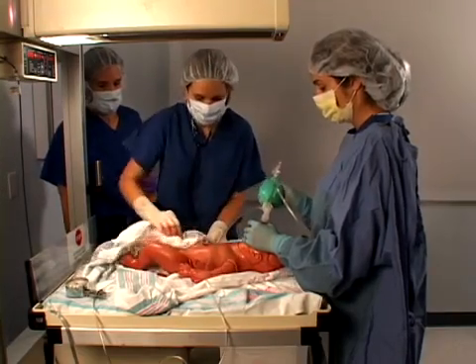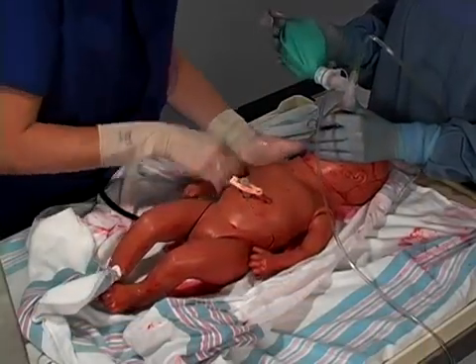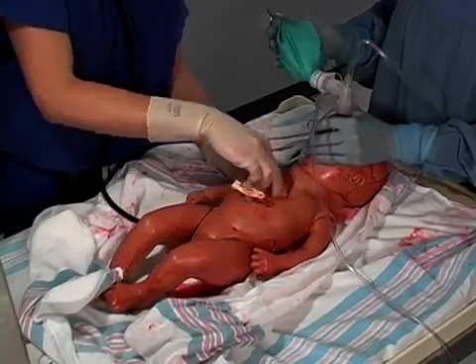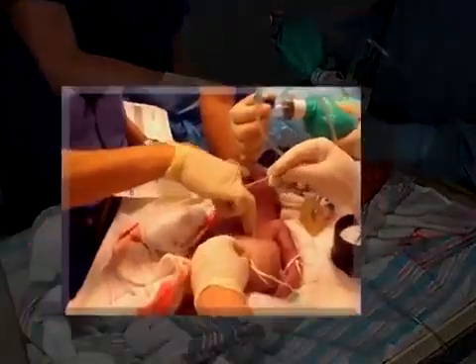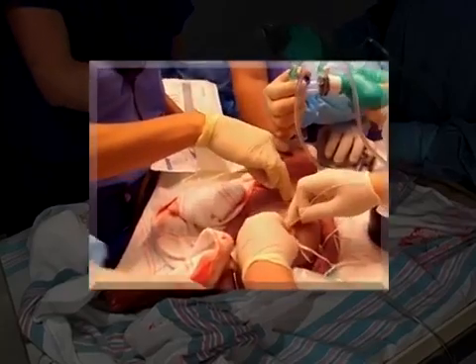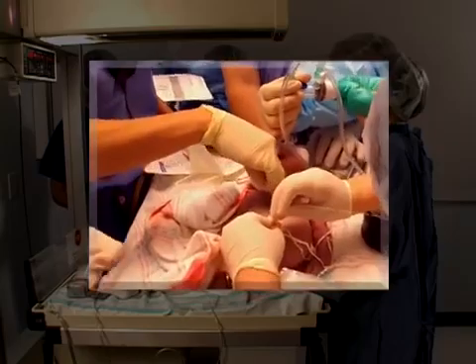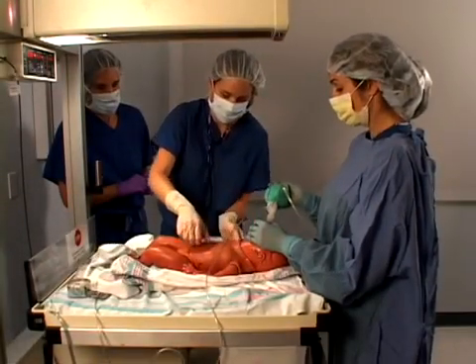Heart rate feels low. It feels about 20. So I think we're going to need to start compressions. Okay. 1 and 2 and 3 and breathe. 1 and 2 and 3 and breathe in. 1 and 2 and 3 and breathe. I think it's been about 30 seconds. Breathe in. I'm going to recheck.